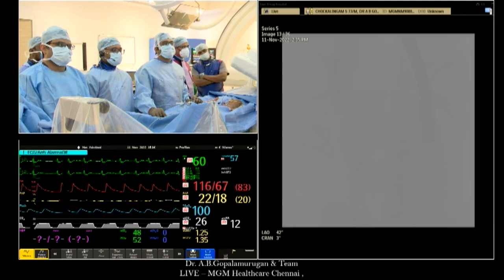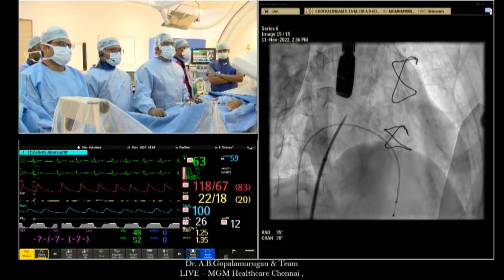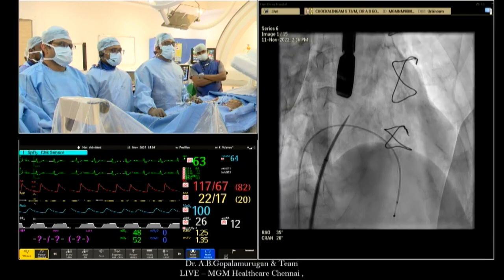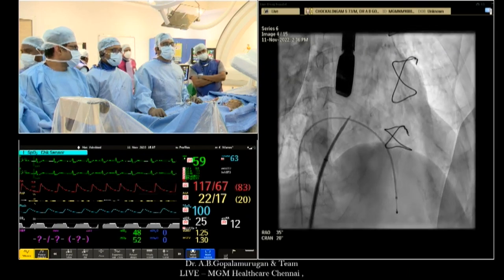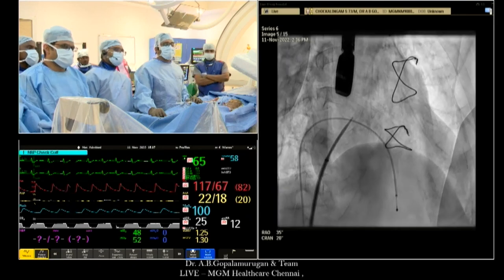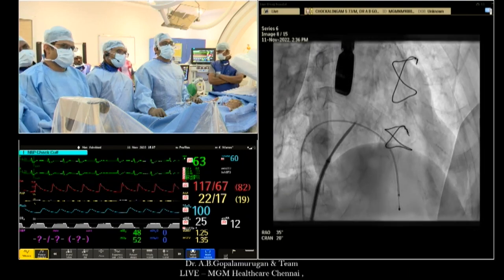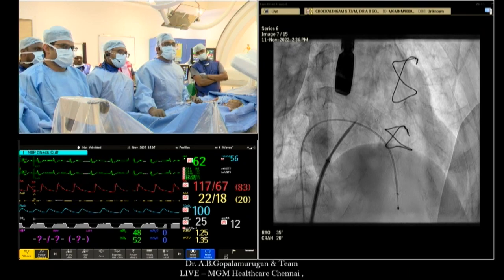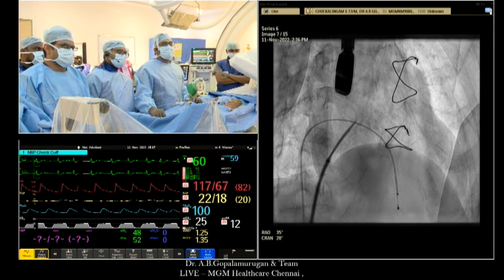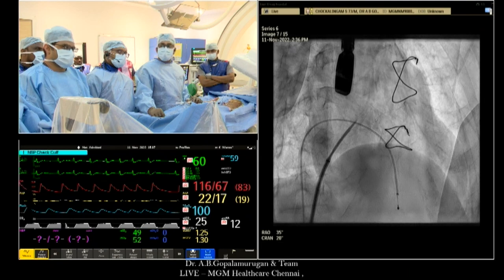So Gopal, what will be the strategy? TEE-based or a fluoro-based puncture, which do you prefer? It is never fluoro-based because it can never be done that way; you need a posterior and inferior puncture, which fluoro cannot guide based on the mitral valve trajectory. I'm showing you an RAO of this patient to appreciate the valve trajectory. I hope you can see a thin line, which is the EPIC valve. The downside of an EPIC valve-in-valve, as all are aware, is that it is very poorly visible. Therefore, you only see the wire. You can see here, we've just got it as coaxial as possible. I hope you can appreciate that.